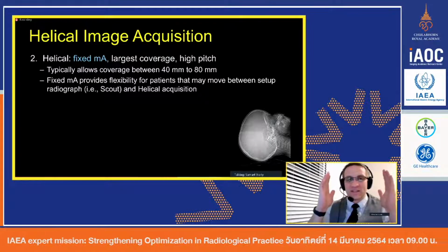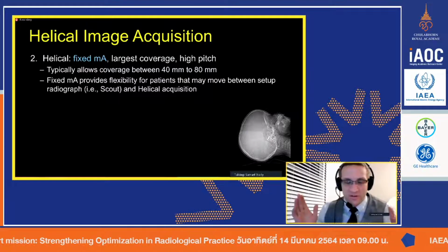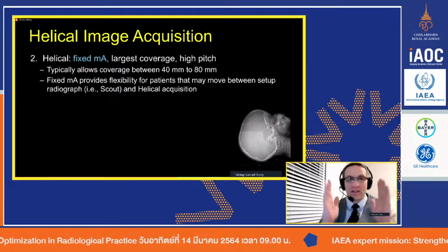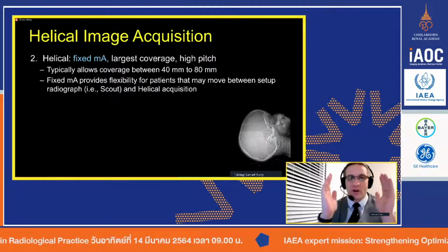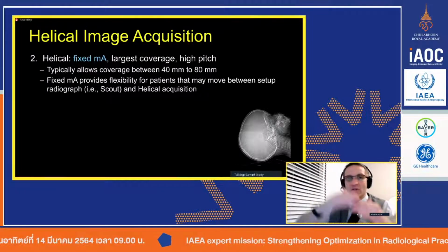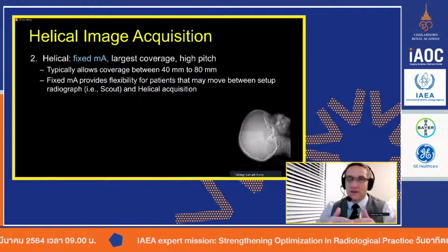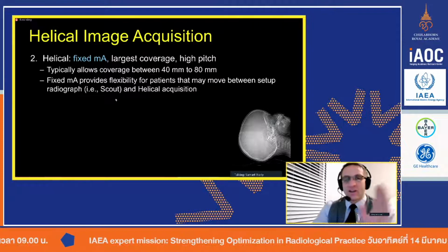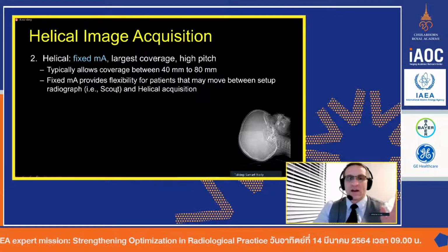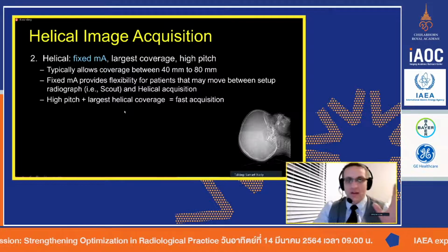When it comes to CT scanner, especially in the body, and we'll talk about this next week, you really got to get the body in there, centered, and aligned properly, or when you use tube current modulation, the system will actually go to extremes to give you too much or maybe even too little MA. So anyway, using fixed MA removes that problem.